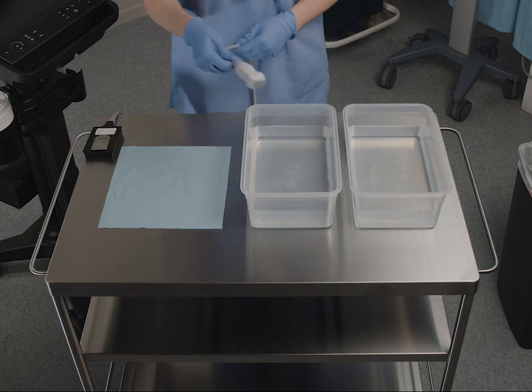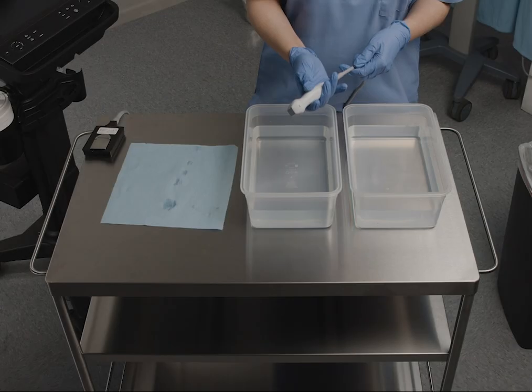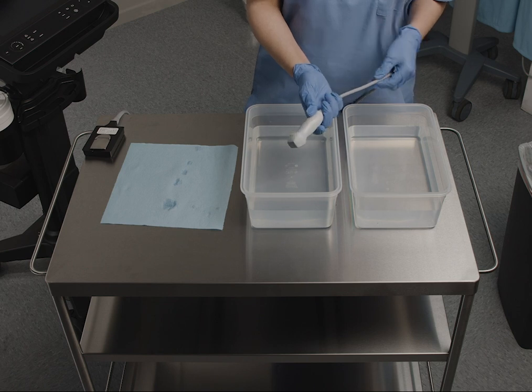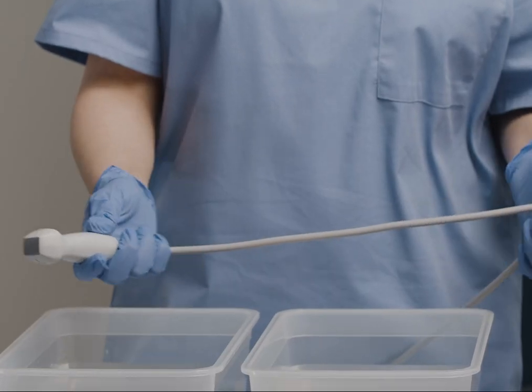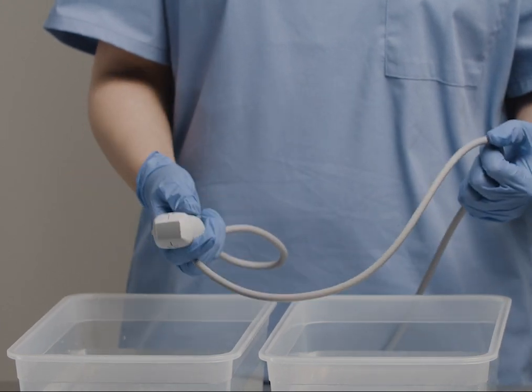Air dry the transducer. Check the transducer and cable for any visible damage. If you do see any damage, discontinue use and contact Fujifilm Sonocyte for service.